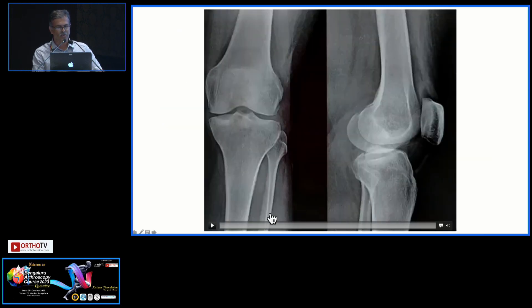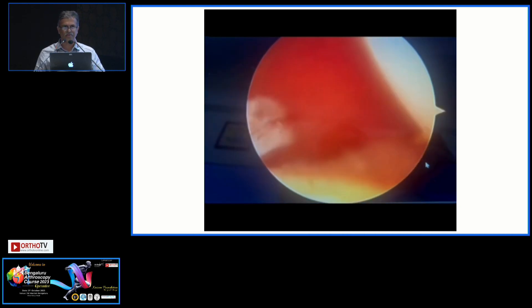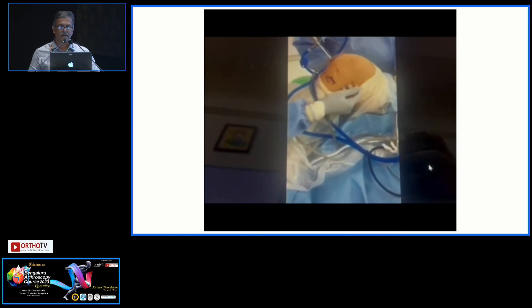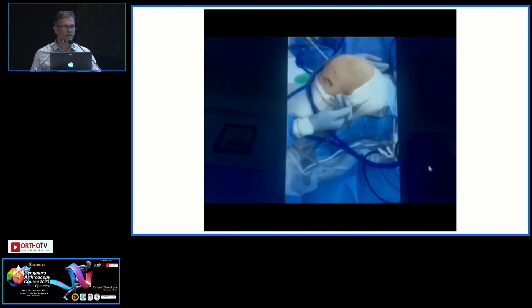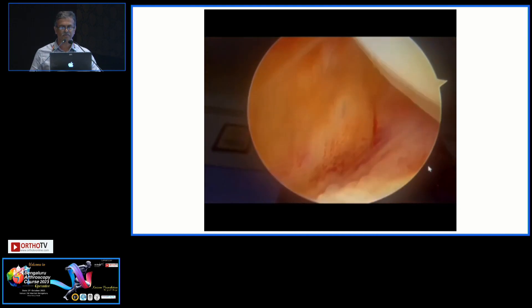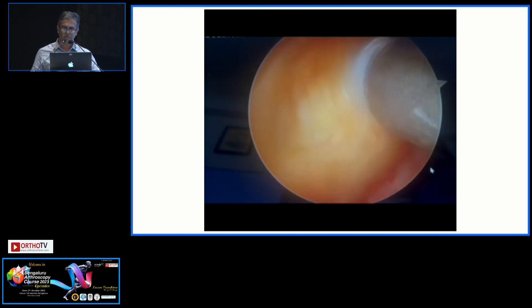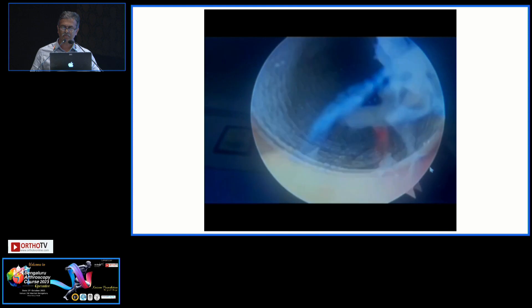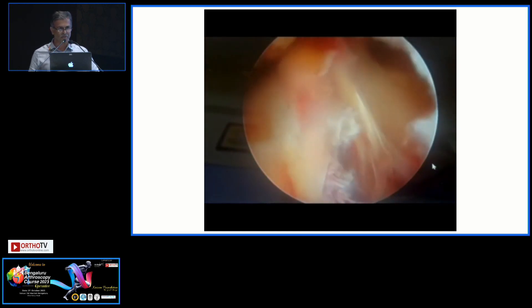This video demonstrates exactly how I do it — this is just an avulsion to demonstrate. As discussed, the posteromedial portal is a must. You have to examine and prepare the bed, and visualizing the fragment from posterior is very, very important. You make the portal with the help of a needle first, then create the portal and put a cannula so that it becomes easy for management later. You are visualizing from the anterolateral portal, between the PCL and the medial femoral condyle, to see into the posteromedial pouch.